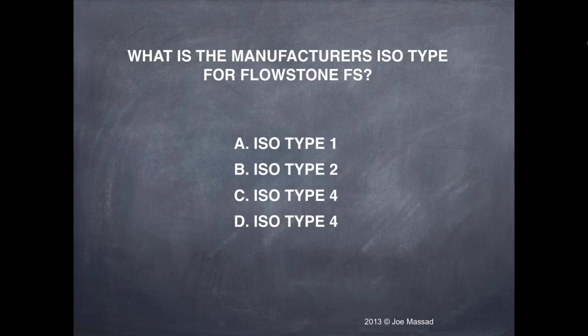All right. What temperature does the thermoplastic tray require to be malleable? 165, and it is an extremely fast cool rate. It will become very limbery, and limbery is the word. When it's limbery, if it's a small tray, it may take 10 or 15 seconds.